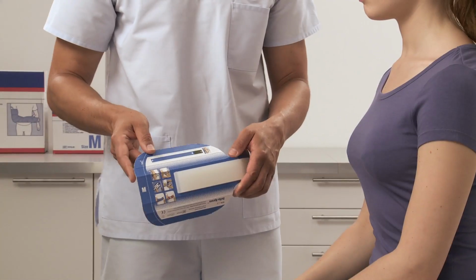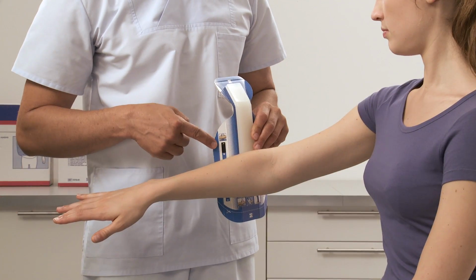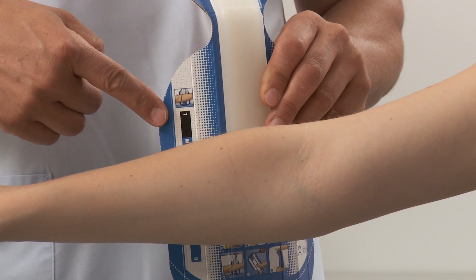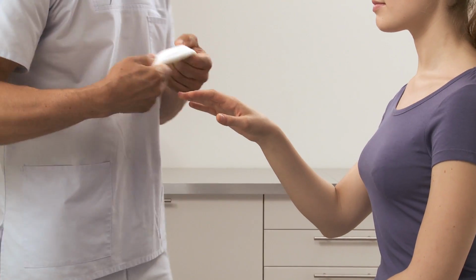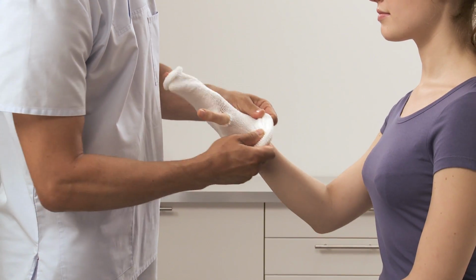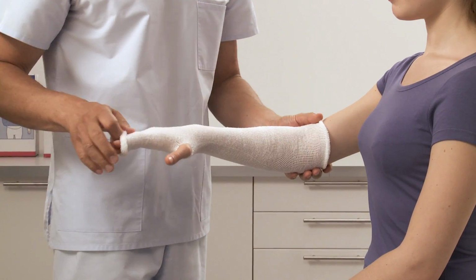Measure the size of the forearm by holding the size scale of the wrist splint to the widest part of the forearm. Choose the correct size of the splint. If desired, apply a stockinette or padding onto the limb on areas of bony prominences to avoid pressure points.